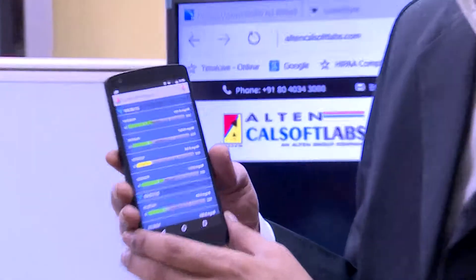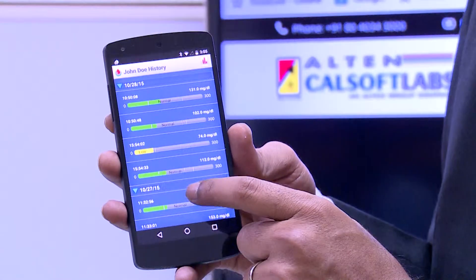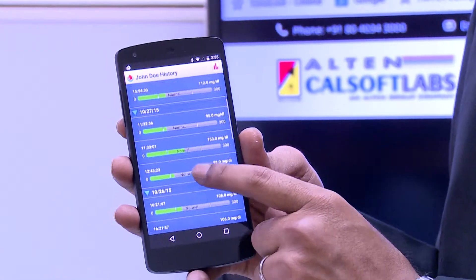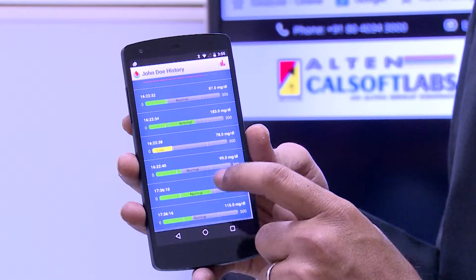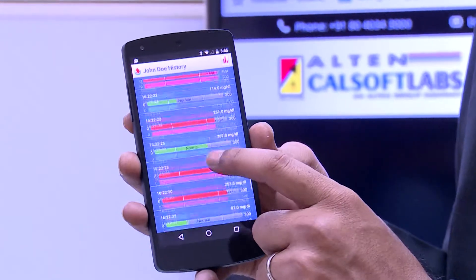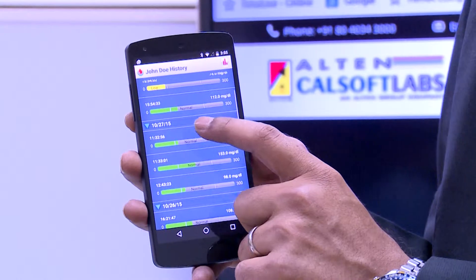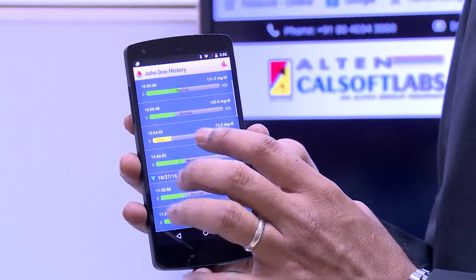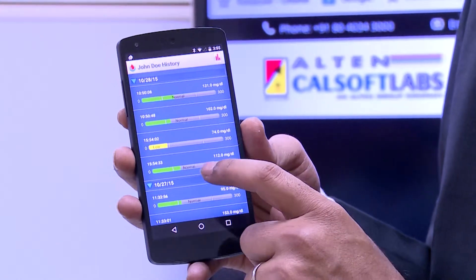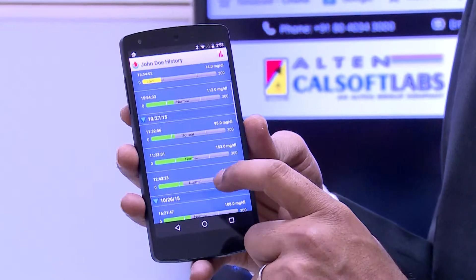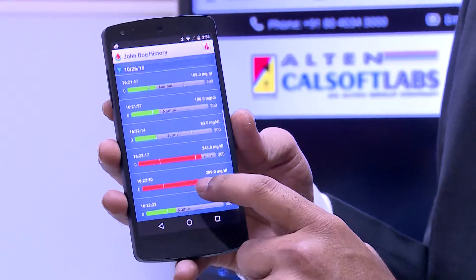On the device as well, the history of the data is available for the end user to see. The green readings are the ones which are well within the defined range. The yellow ones are the ones which are on the lower side.